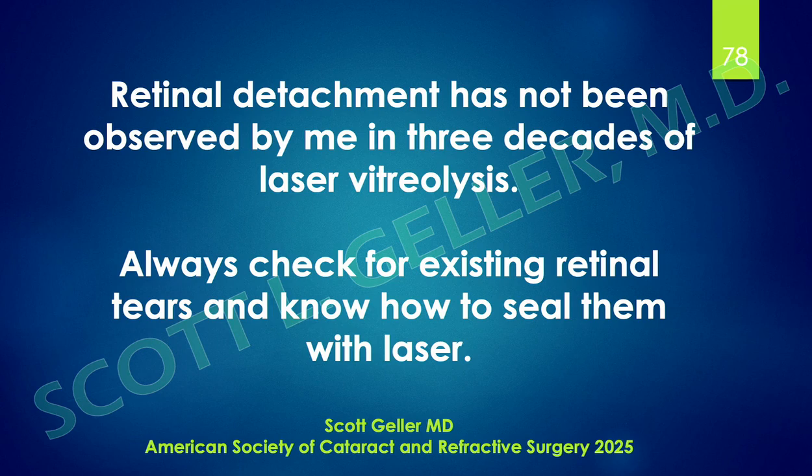One of the ways of avoiding a potential detachment, I can tell you, is checking the patient when they come in, especially those with a PVD, with a Goldmann lens. Look in the mirror towards the pars plana and make sure there are no retinal tears. One of the dead giveaways of a retinal tear is pigment cells in the vitreous.